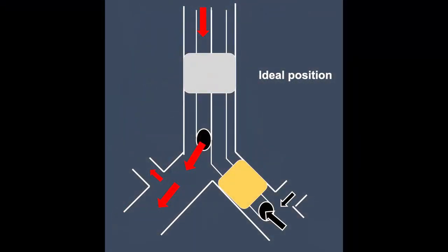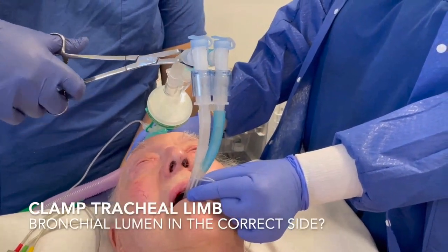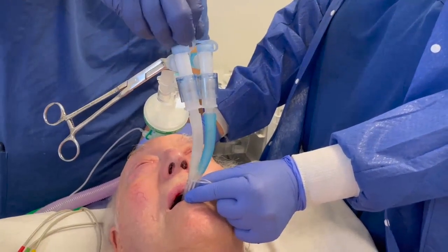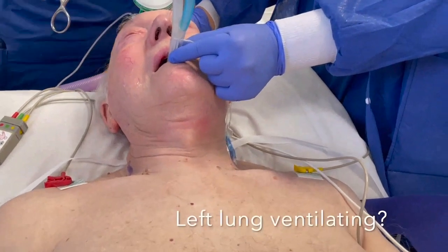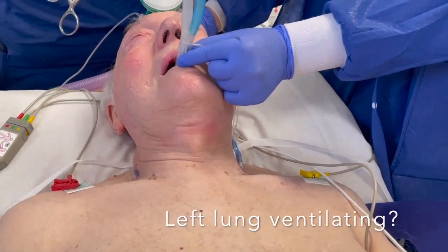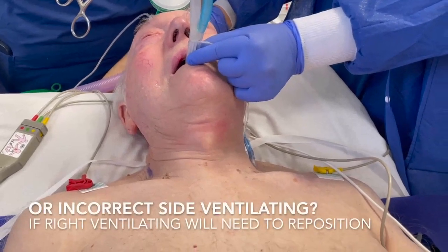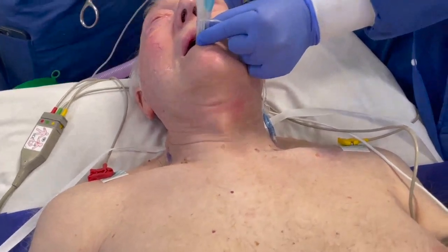The aim is to place the left-sided double lumen tube in the ideal position. To check tube placement in the correct bronchus, clamp the tracheal limb and open the tracheal tube to air. Ventilation through the bronchial tube should be detected mainly in the left lung. If the right lung is ventilating, reposition the tube to the correct bronchus using a bronchoscope.